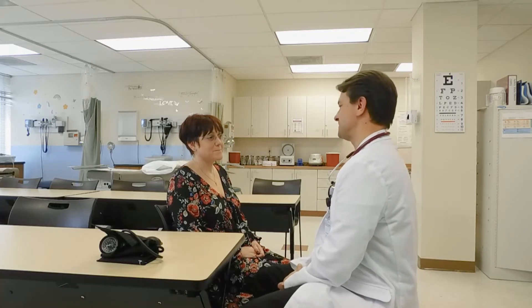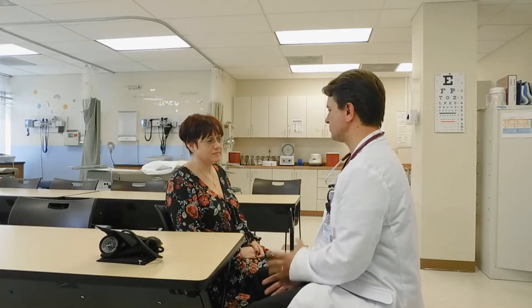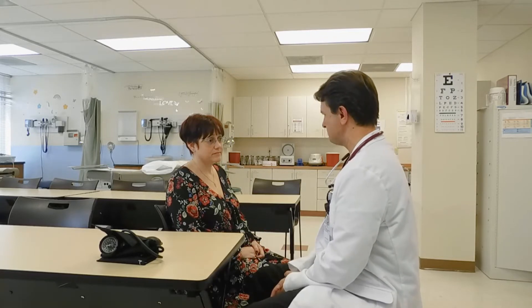Hi, I'm Dr. David Roberts. I'll be helping to take care of you today. May I have your last name and date of birth please? Last name is Morgan Tootin, date of birth is 9-15-1974. We're going to take your blood pressure now as part of your vital signs to help track your blood pressure condition. Is it okay if I touch your arm? We always begin by identifying ourselves and the skill we're going to do, then identifying our patient to make sure we have the right patient at the right time. We always want to ask permission to touch so that we are respectful of the patient's comfort and boundaries, and let them know they can trust us.